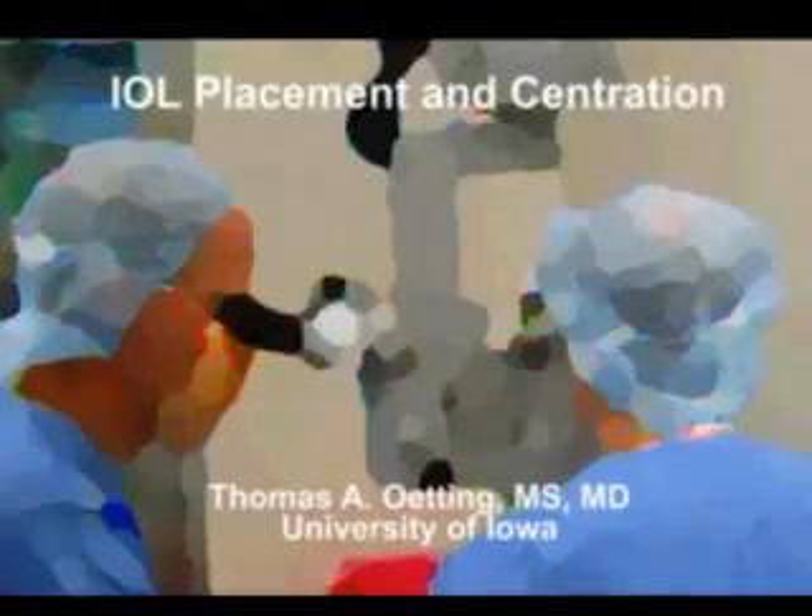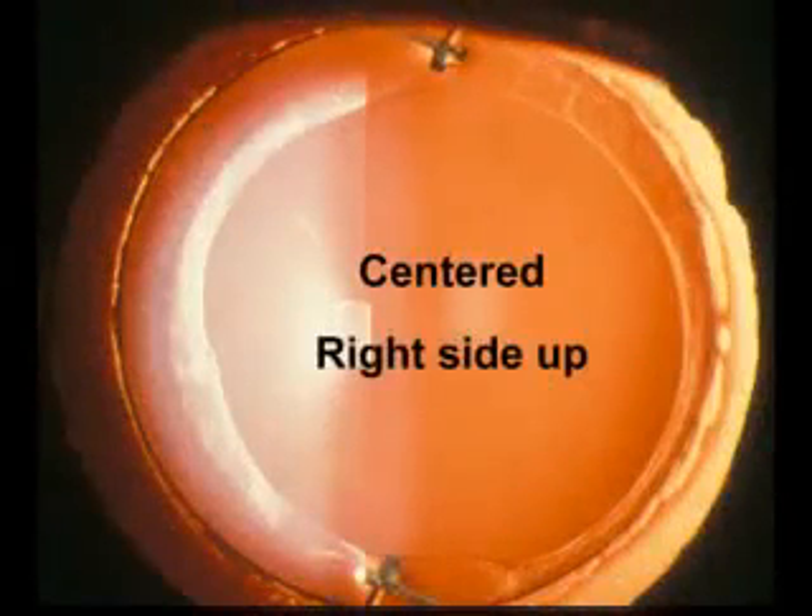Hi, this is Tom Oding from the University of Iowa. This is a DVD on IOL placement and centration. Our goal with placement of an ocular lens is to have it centered and right side up.